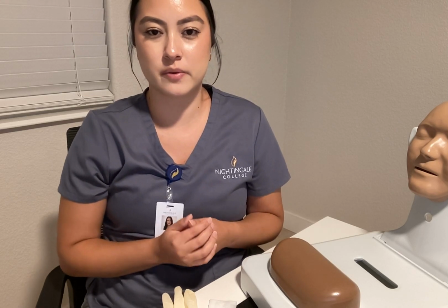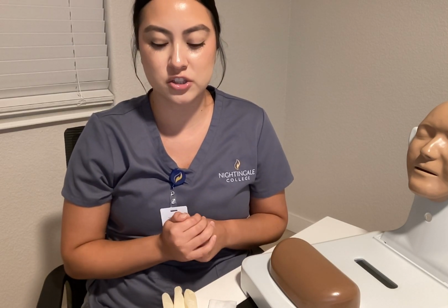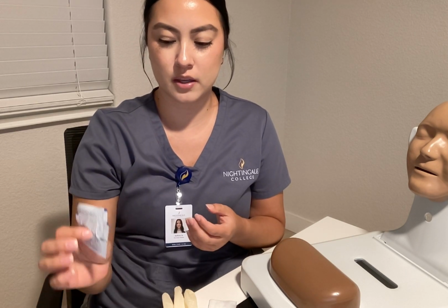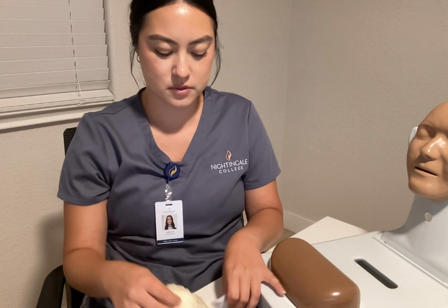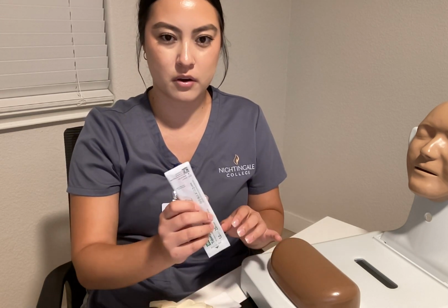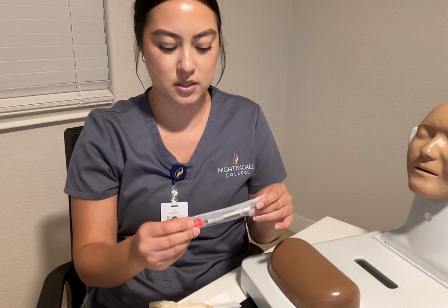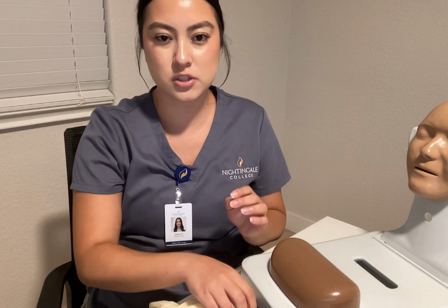Today we're going to be doing a subcutaneous injection. We have our heparin, we have the alcohol wipes, gloves, gauze, and then we have our needle and syringe. This is the 25 gauge by 5/8. This is a 1 ml syringe.